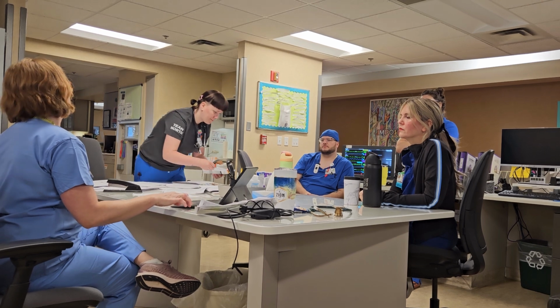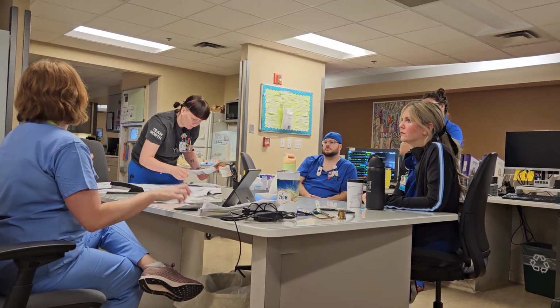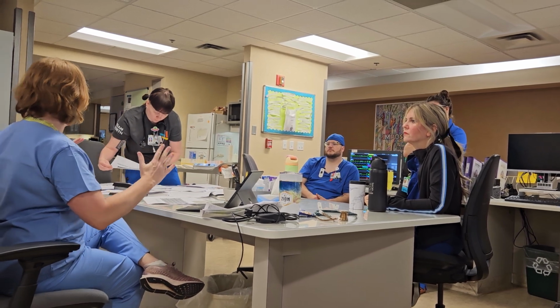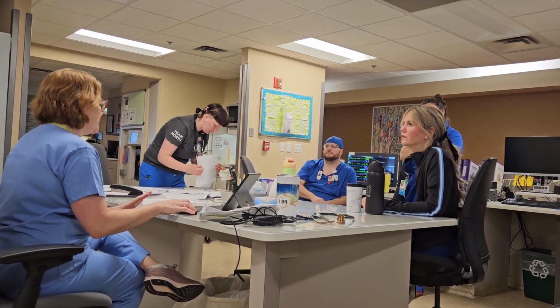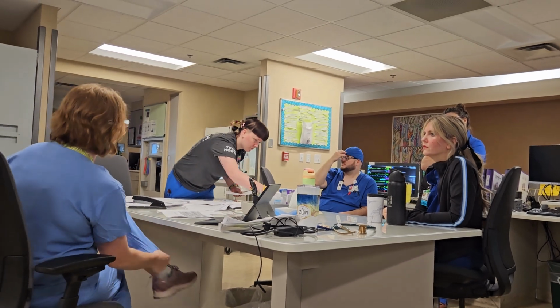The other things that are adjustable are flow rate and inspiratory time, and essentially they are the same. If you decrease the inspiratory time, it'll increase the flow rate and vice versa, which is relevant to certain vent settings, but we're not going to go into it too much because it's very much an RT thing.